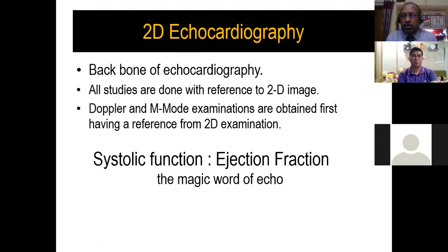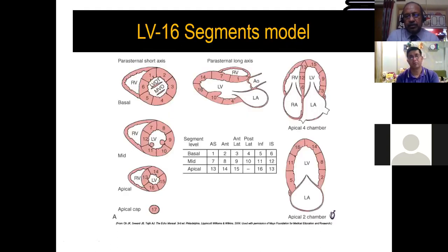Like somebody, if you talk of echo, he says, what is the ejection fraction? But I can assure you, by the time you finish your course, the ejection fraction plays only a minuscule part of day-to-day echo programs.